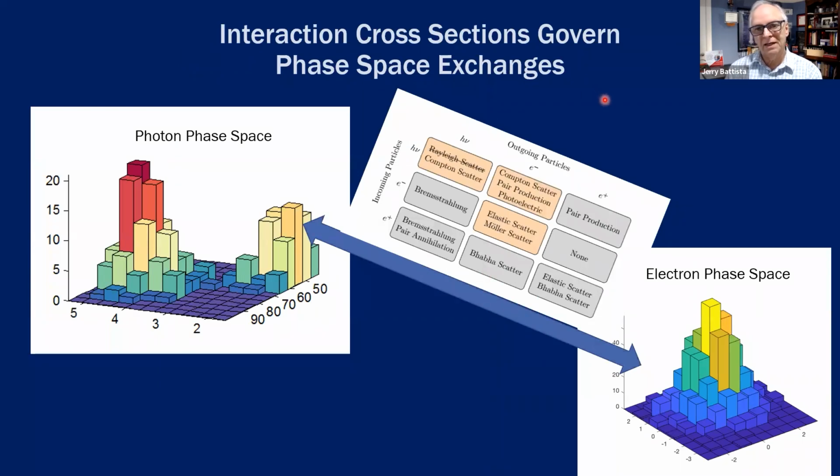It's more complicated if you do photons from X-rays because of the electrons that are set in motion. So you actually need 2 of these phase spaces, a photon phase space and an electron phase space, and the particles can exchange back and forth and populate each of these, depending on if a photon produces an electron or vice versa, like Bremsstrahlung. So these 2 are constantly updating these fluence counts based on the interactions.